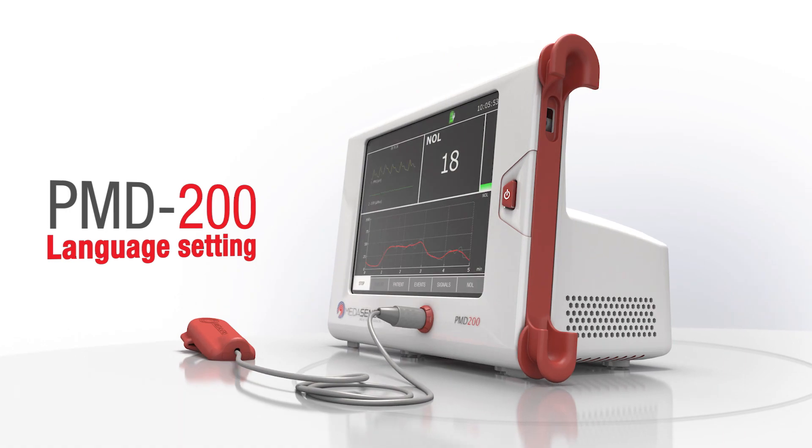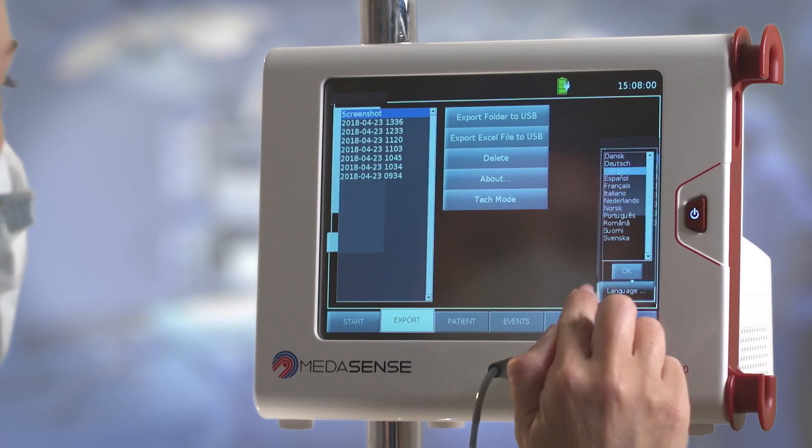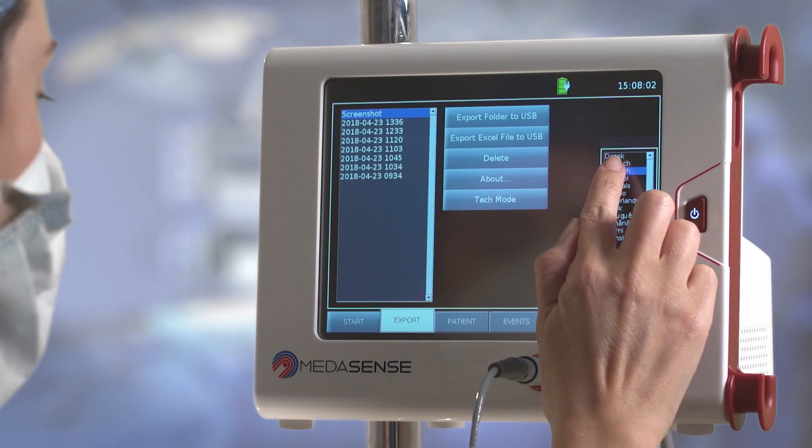Language setting. To change the language, press the Export button, then press the Language button and select the desired language.